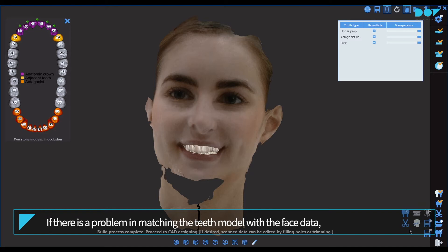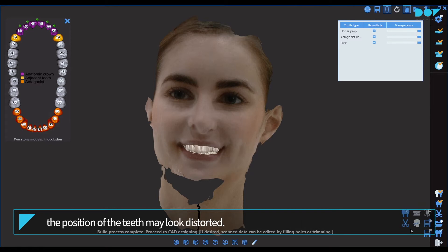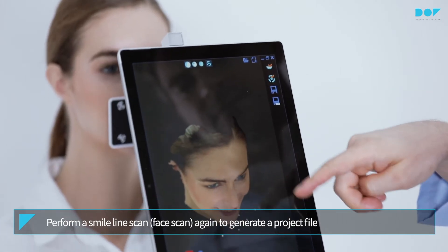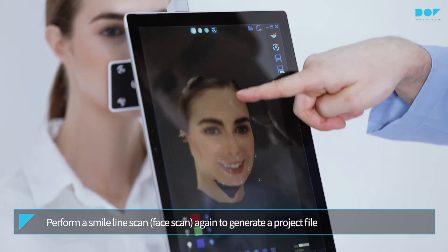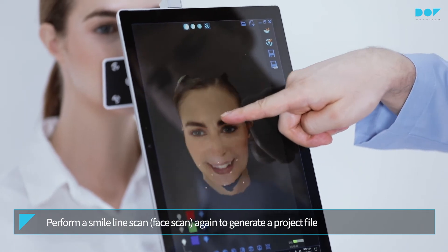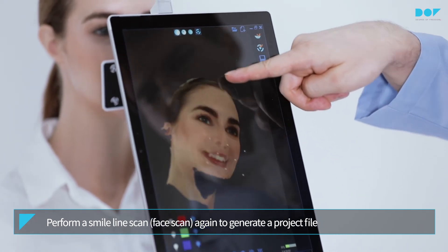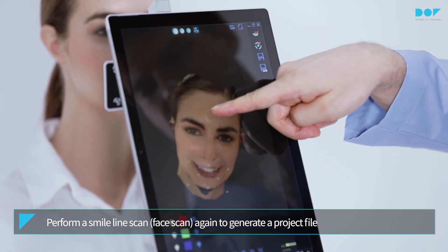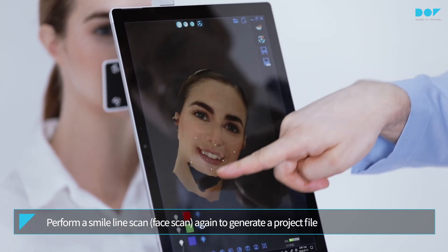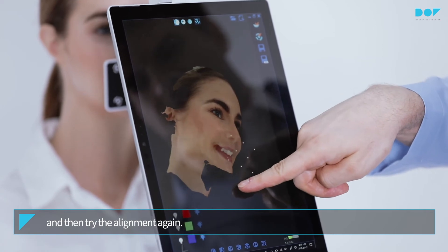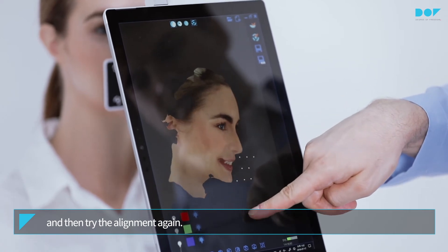If there is a problem in matching the tooth model with the face data, the position of the teeth may look distorted. Perform a smile line scan and face scan again to generate a project file, and then try the alignment again.